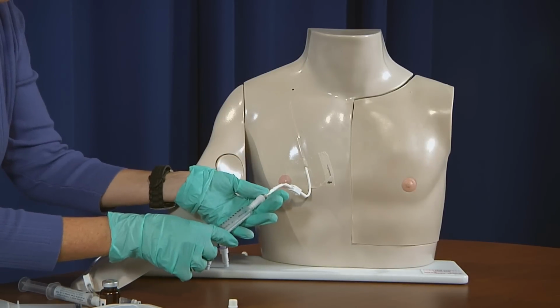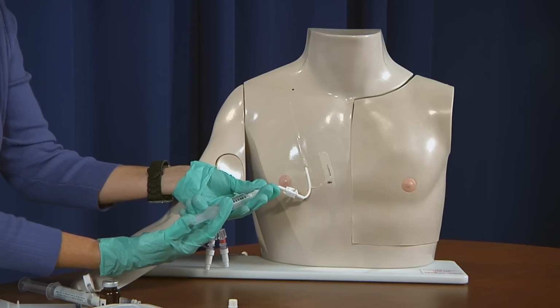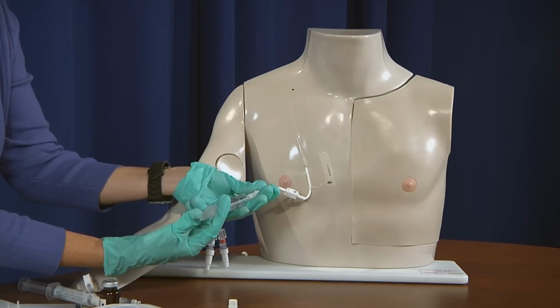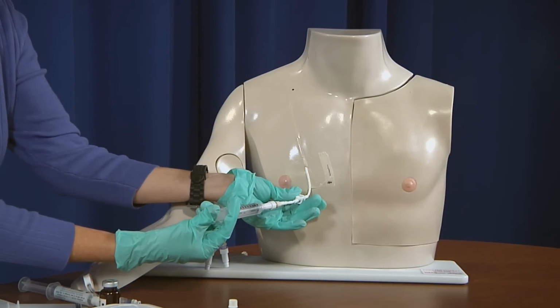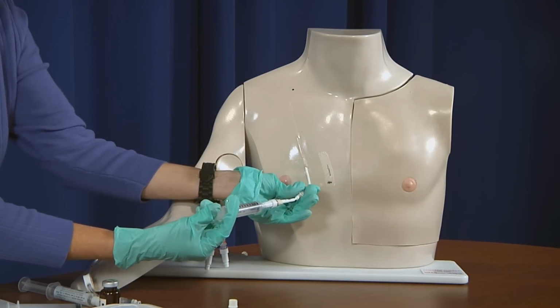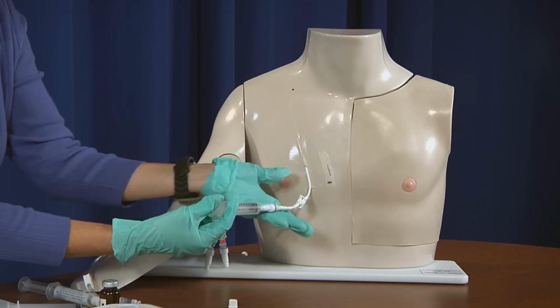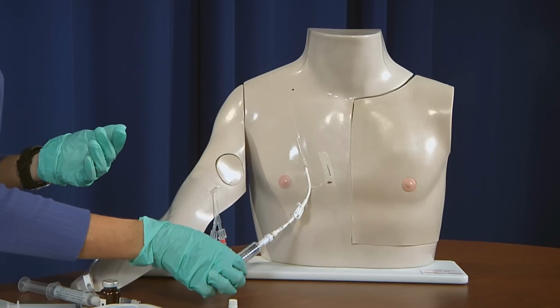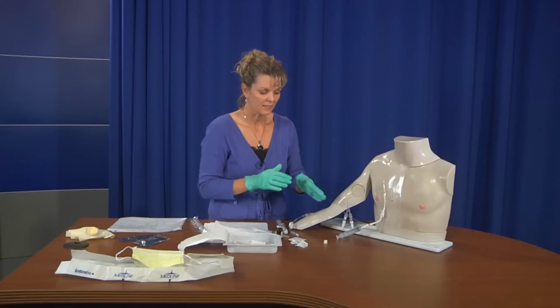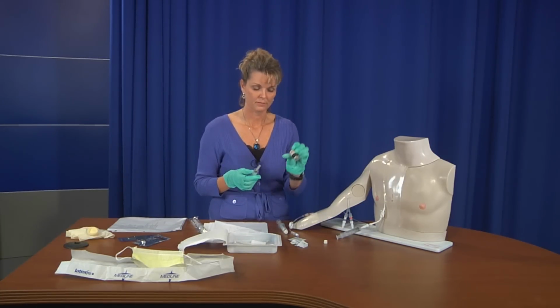So once you see a blood return, then you want to inject the saline slowly until it's almost out. Let's say about a 1 cc. As you're injecting it, when you're finished, clamp this off. So it kind of has a pressure behind it while you're clamping it. That's an old clamp. Here we go. Now leave this on. You've already cleaned the site for 15 seconds, and as you know, that took a while. So we're going to leave that on because it's still sterile. The next thing we're going to do is we're going to draw up our medication.